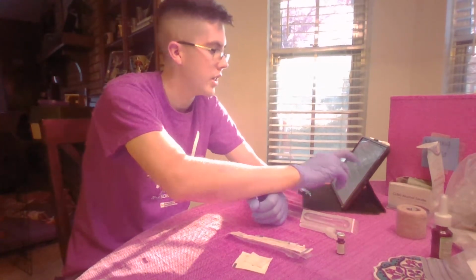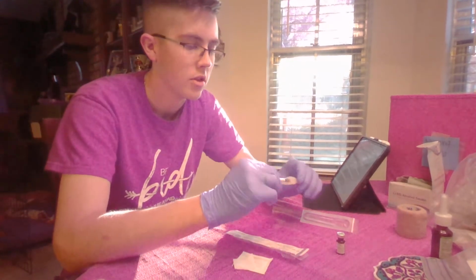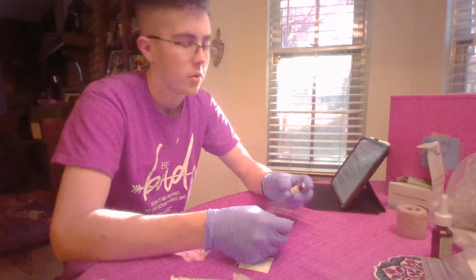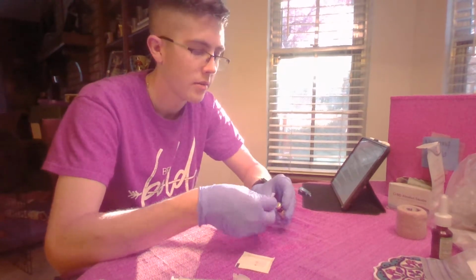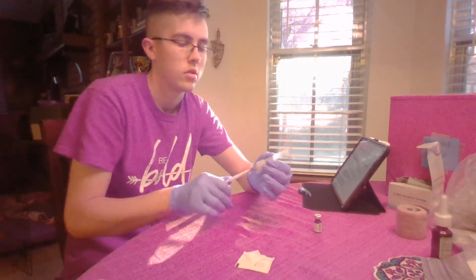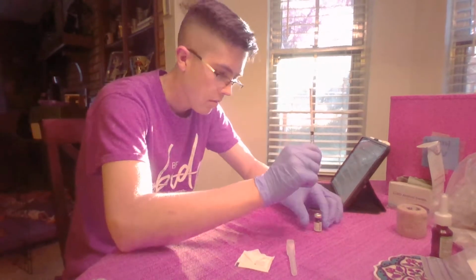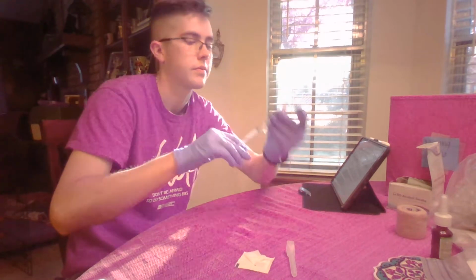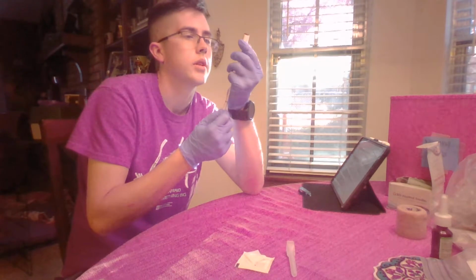And then after I've done all that, I will then assemble my needle, do it as best as I can to make it sterile. Re-inspect my medication, make sure it's the correct one, clean the top of it. Pull back 1 milliliter of air. Inject 1 milliliter into the vial. Pull out 1 milliliter.